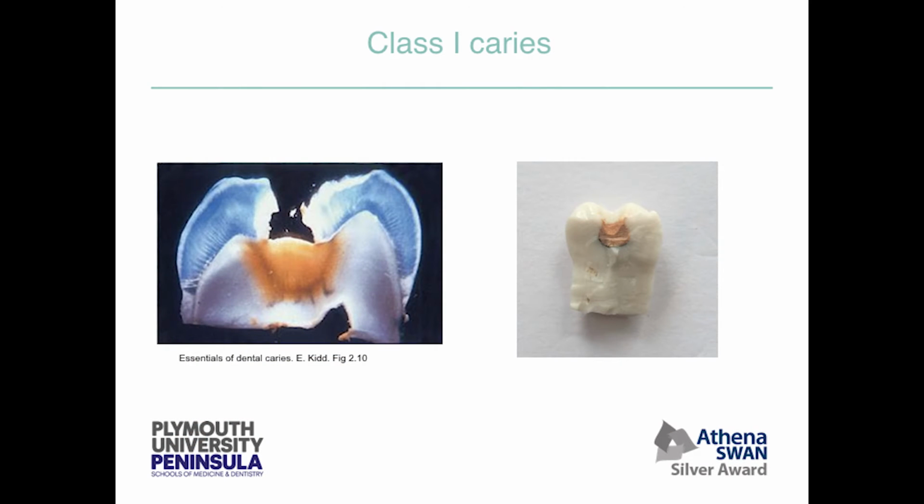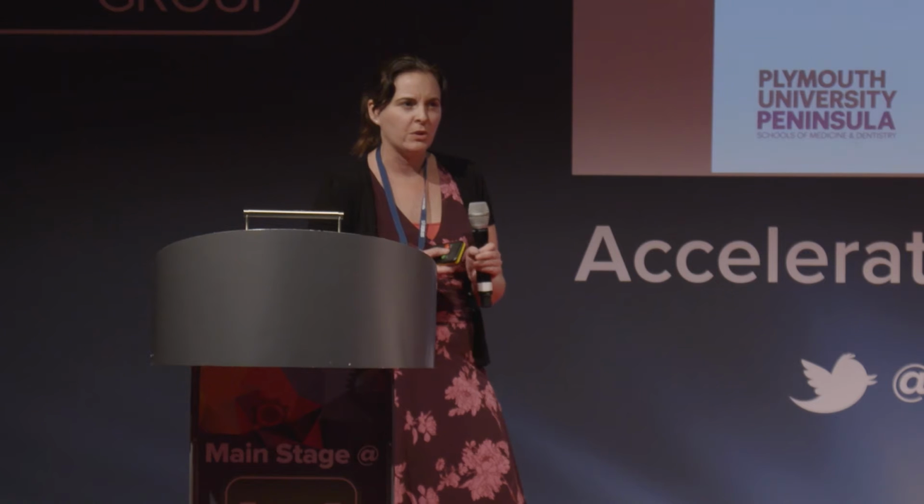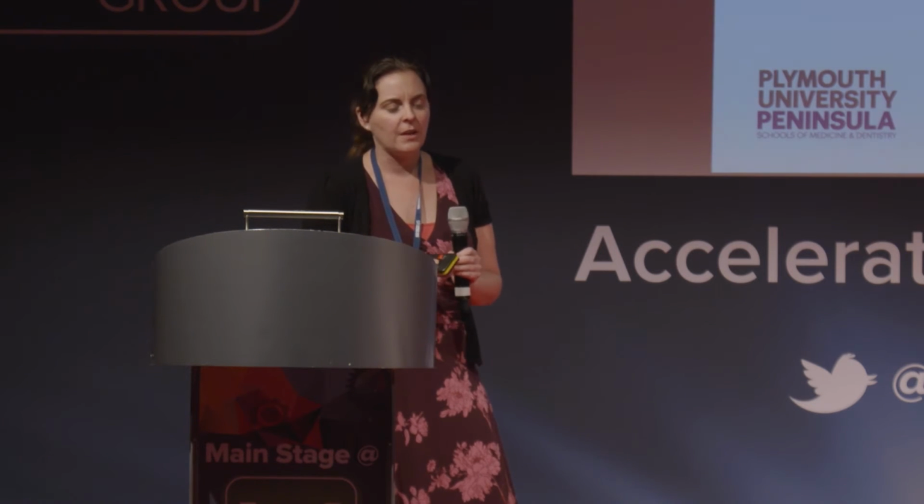And then the picture on the right of the screen is the cross-section of the current teeth. So you can see we have managed to get the shape roughly. It is bigger at the bottom than at the top, but it's certainly not the correct shape completely, and it's also not got those layers in. So there's no enamel, dentine or pulp, which again is really important as landmarks for our students to know when they should be using different burrs or when they should be stopping drilling. So basically it's for helping them understand the concepts.